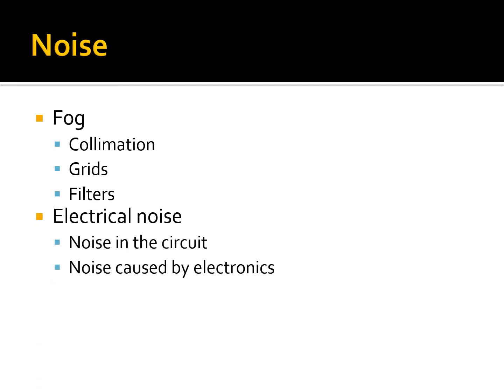The conversion of radiation into a digital signal requires several electrical transformations. Along the way, noise or random signals can obscure the image. Computer algorithms are implemented that allow the computer to ignore signals thought to be noise. Increasing the ISO rating, effectively speeding up or increasing the sensitivity of the imaging plate, will increase noise. Much like taking a photograph in a low light situation where the image becomes mottled or grainy.